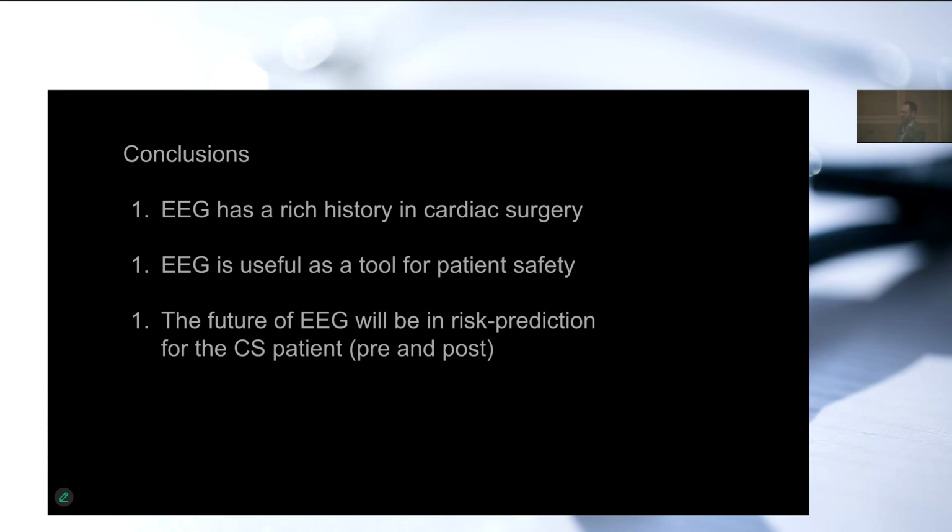The problem is that the signal to noise ratio is very, very poor. And in the operating room, it's particularly bad because we use electrical surgical instruments that have electromagnetic interference that is orders of magnitude higher in amplitude than the EEG. So getting an artifact-free period that will be suitable for applying machine learning continuously, because it needs to be something live, right? It turns out to be a very difficult problem.